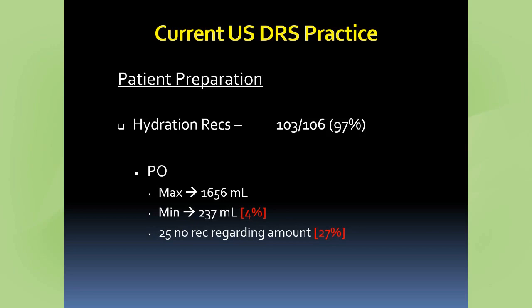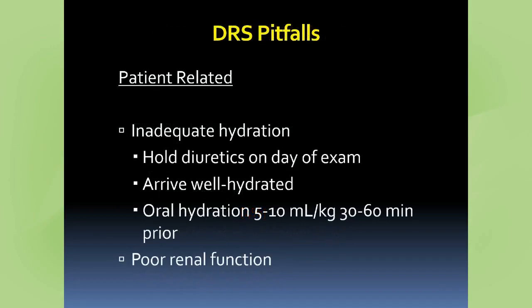Again, in practice, they may be giving more discrete guidance, but it's not in protocols or in reports that we can tell. So what this results in is that there's only about 2/3 of us out there who are complying with current patient preparation recommendations from our societal guidelines.